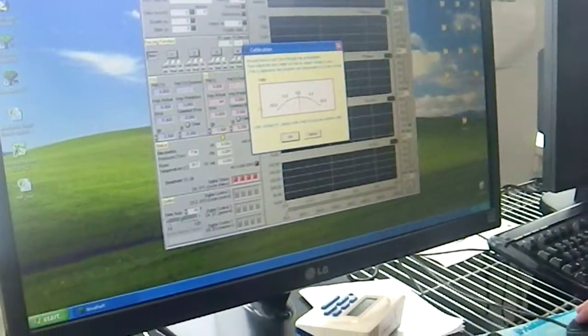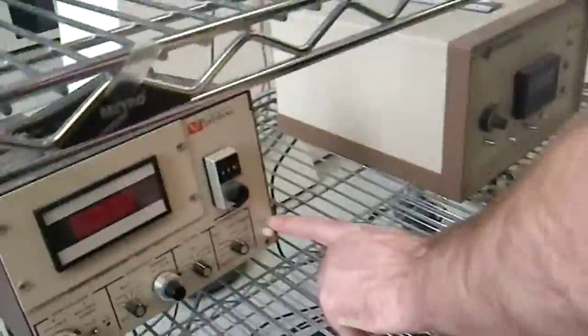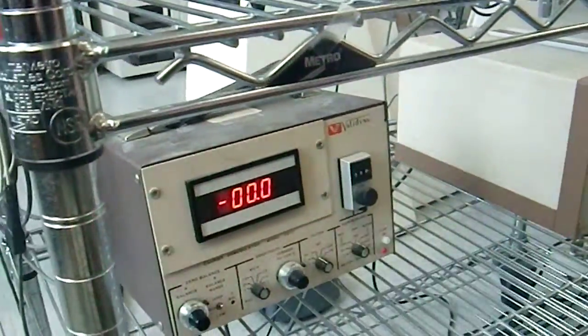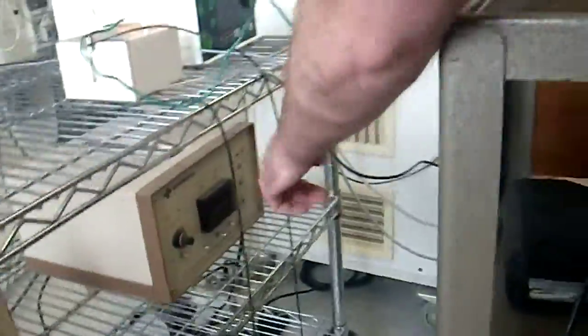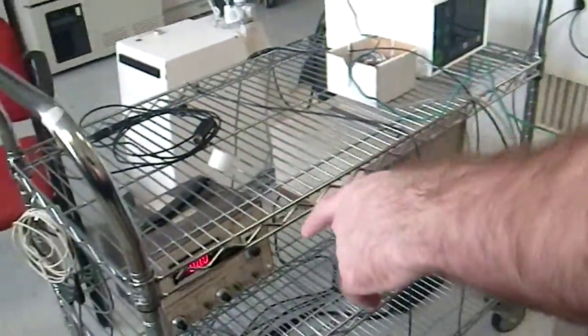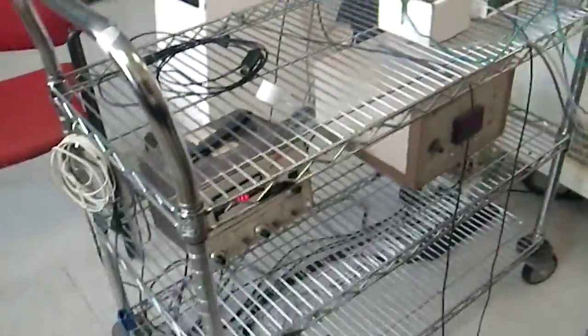So now it's going to try to measure the volume. You have to make sure that these two machines are turned on in order for it to measure. This one here is for power. Push that on. This number should be right at 0. So that's good. Over here, this one's also on the far right at the bottom. So you just flip that on and you'll see the numbers. This one's measuring flow, this one's measuring volume, and it sends the signal to that computer.